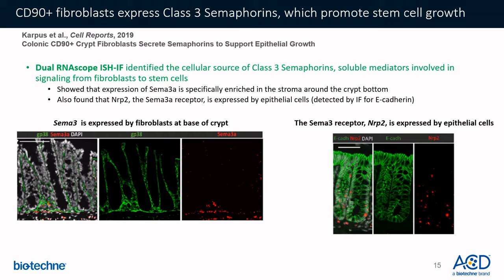The previous sequential workflow that is used by this customer works in a way where you perform RNAscope first, and then you perform the antibody detection to look at the simultaneous RNA and protein in the same tissue context. We did recently come up with a new version of this workflow called the co-detection workflow, and I will talk about it in some of the later slides.